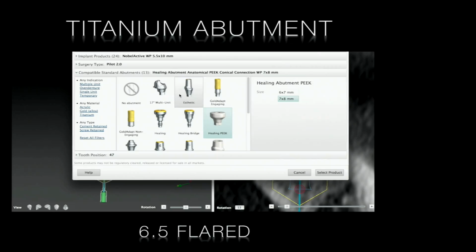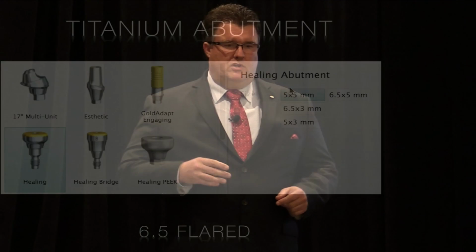When we're doing this, we are able to also choose our typical titanium abutment that everyone's used to. If we want to have that as well, just look what happens when I put the emergence profile based on my computer model. I can see both are going to work to make sure that we seat the crown down. It's going to be a good case to finish on.